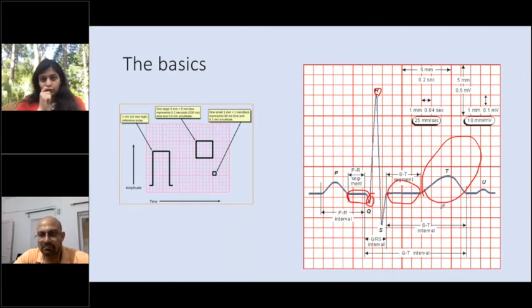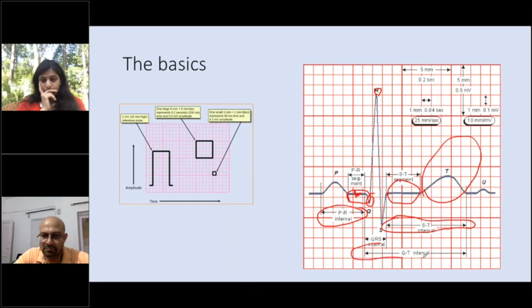A very basic concept: what is a segment and what is an interval? There are two main segments, PR segment and ST segment, and three intervals: PR interval, ST interval, and QT interval. An interval includes the wave. The duration of P wave plus PR segment is the PR interval. Duration of ST segment plus T wave is the ST interval. The duration from beginning of Q wave till the end of T wave is the QT interval.